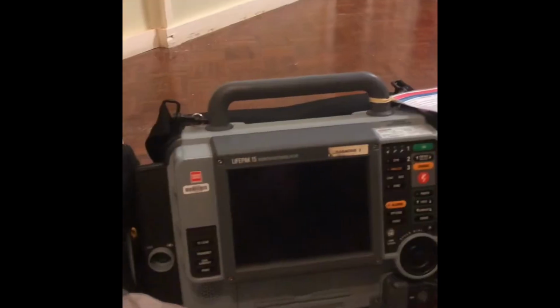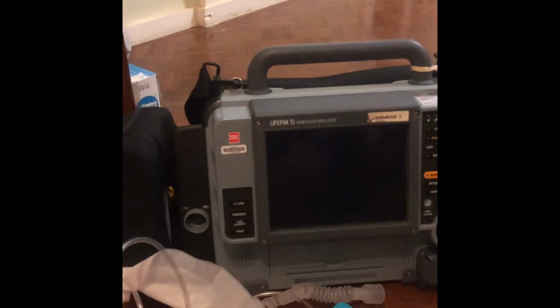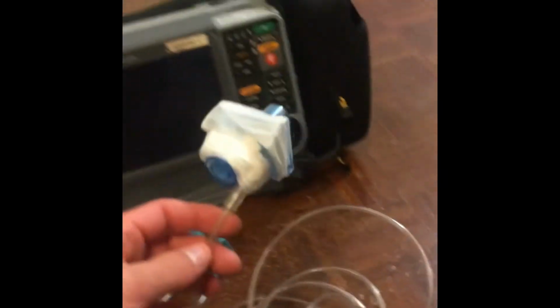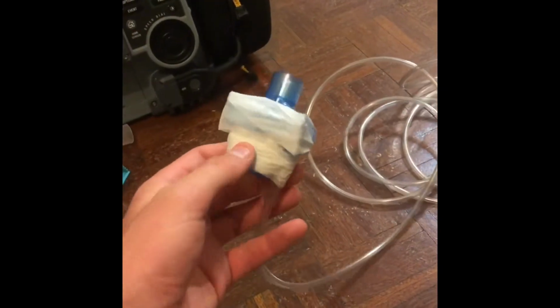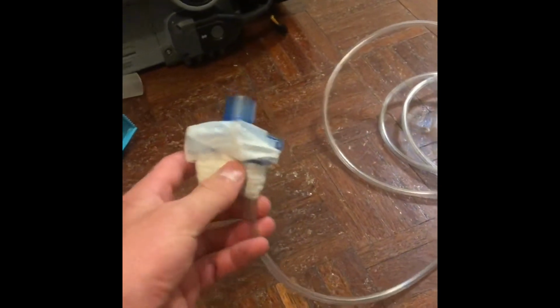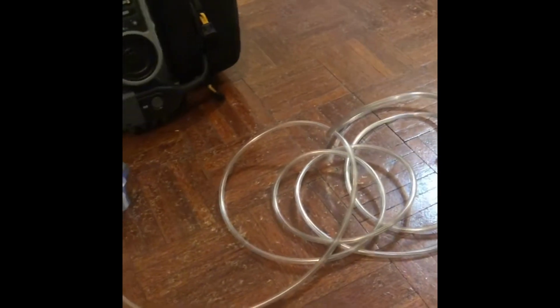So now we'll go through some of the equipment that we're going to require. We're going to need a monitor capable of end-tidal CO2 monitoring. This monitor is not capable, but for the sake of this demonstration, it will be. We'll need an end-tidal CO2 detector, either a sideline or an inline. The only difference is in an inline, the sample is taken within the circuit, and in a sideline, a sample is taken through the line and analysed within the monitor.